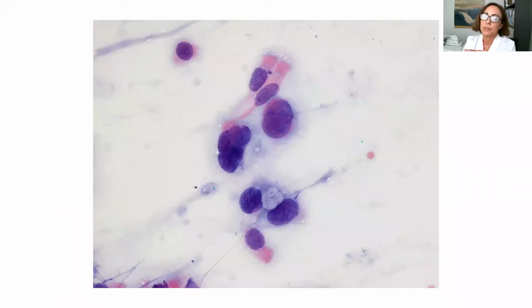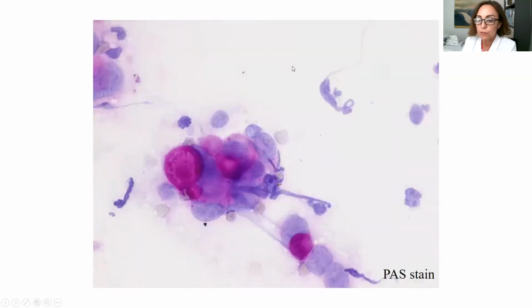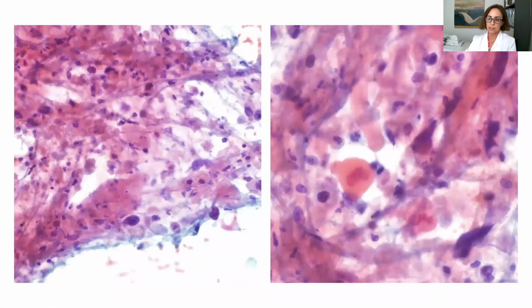But sometimes for us cytopathologists, it's very easy to diagnose cancer by cytology. Look at this case. This is 1, 2, 3, 4 cells, and with these 4 cells, we can say that this is an adenocarcinoma without any doubt. And look here at the nice bronchial cells with the cilia. If we perform a PAS stain, which is very cheap and very easy, we can see the mucin in the vacuoles of these tumor cells. So sometimes, as you see, it's very easy to diagnose an adenocarcinoma.